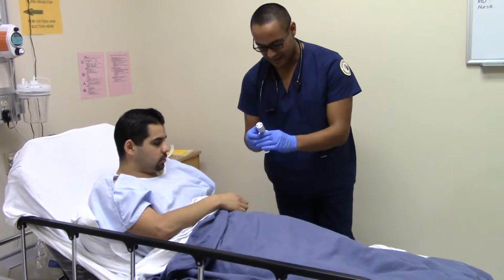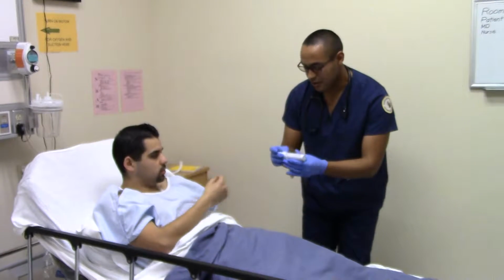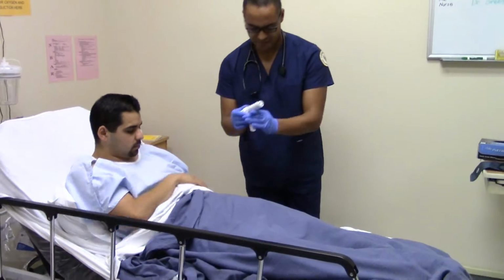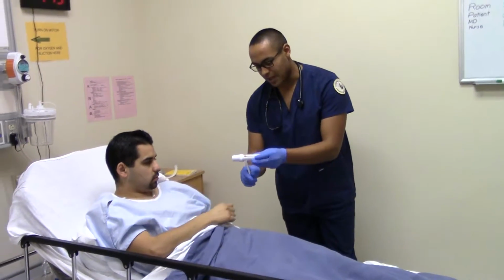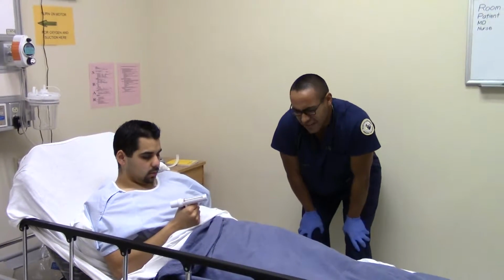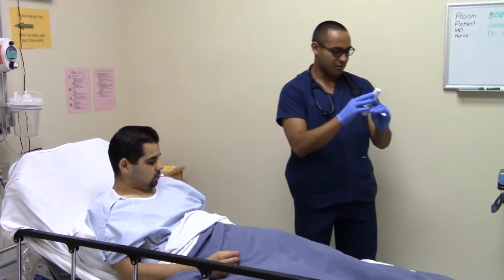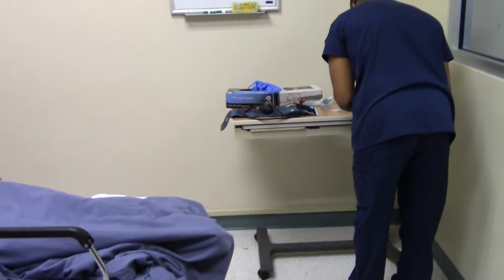Nice. Okay, good, good. I wish I knew what number he got, but I don't. All right, good. Now try again as hard as you can. Breathe out. Go ahead and just breathe out as hard as you can. Nice. Okay. Good, good. All right, one more time. Last time, how do you feel? Wheezy? Okay, all right. Go ahead and take a breath in, breathe out as strong as you can. Okay, nice. I see improvement. Third time a little bit stronger. I'm going to put the numbers down. All right, 350.